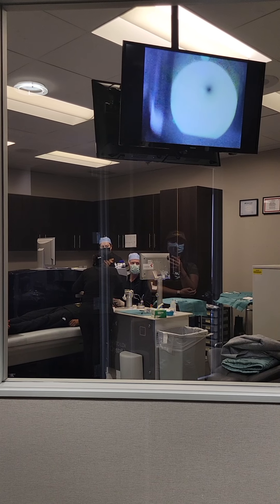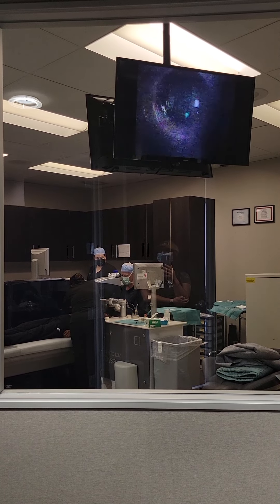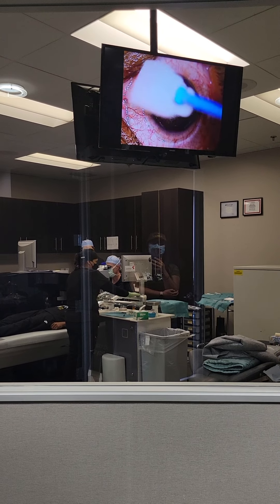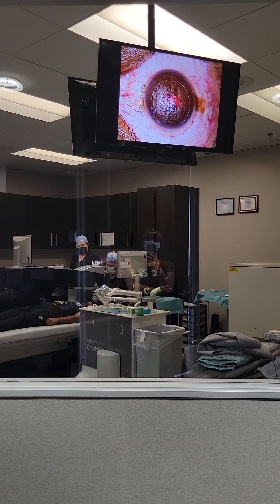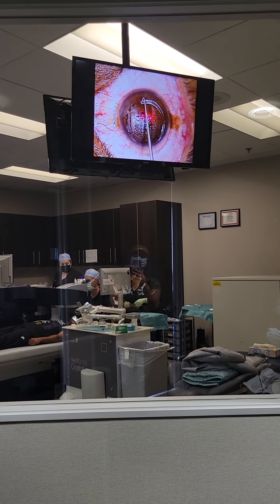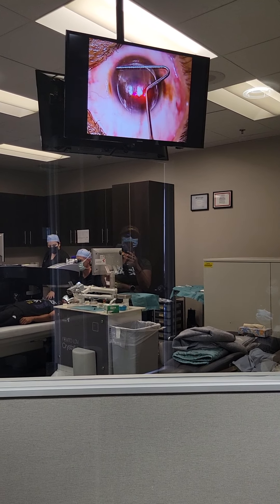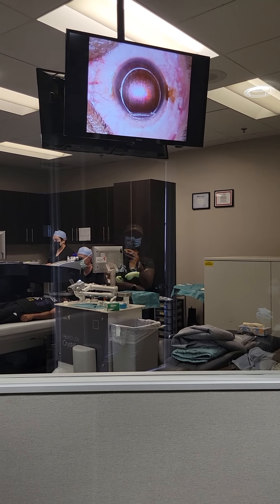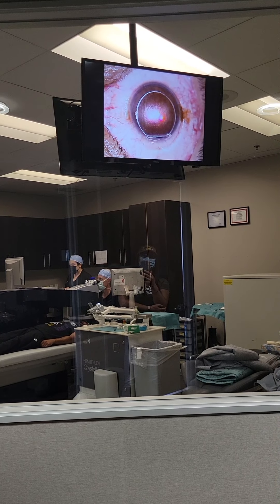What is that? Oh my gosh, look Ches. What's it? What's his eye? It's not red. What the... How are you supposed to not do that? Because they numbed it. See? Oh, that's the color? No, that's the top layer of his eye. What? What was it in his color? No. I thought we'd put it back again. Just put it back on top.